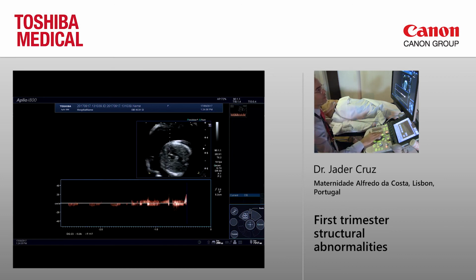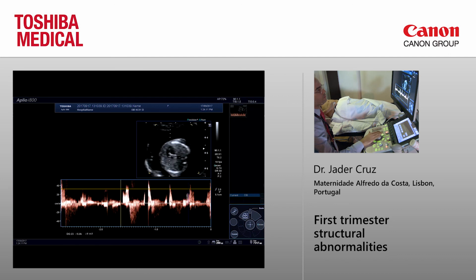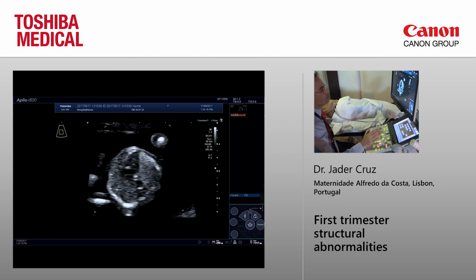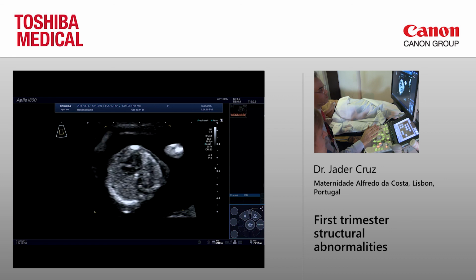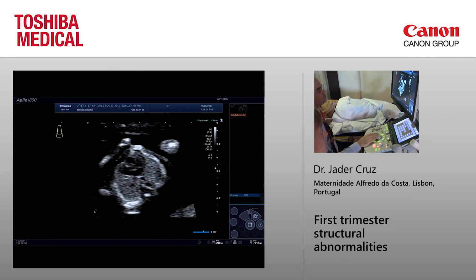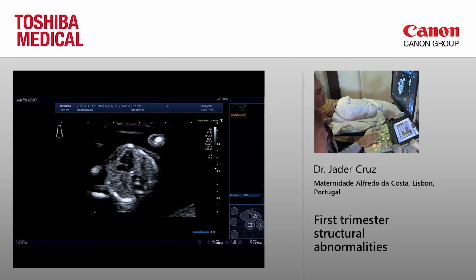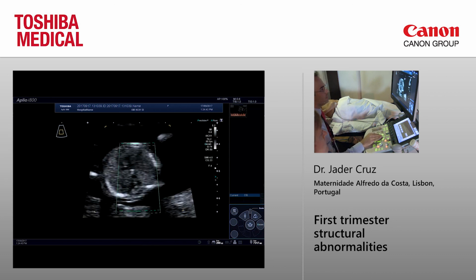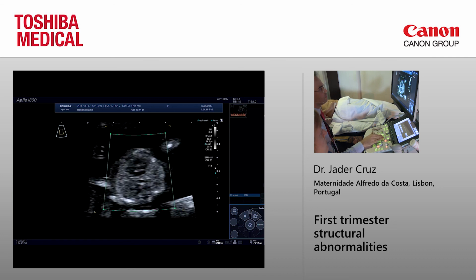And that's the tricuspid there. You don't need to use the color, you just need to place the gate in the right place. What you try to do is sample across the valve. You start close to the septum, and then you move along the valve to assess the whole valve. Okay, now I'm just going to move on to ADF because the baby now is behaving.